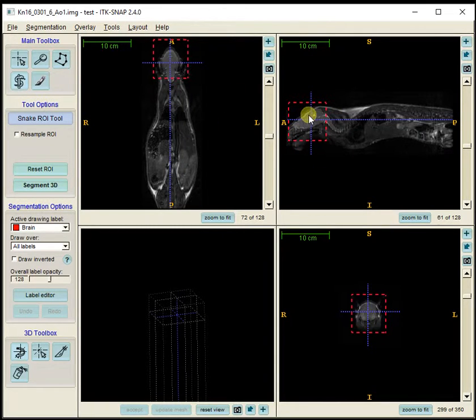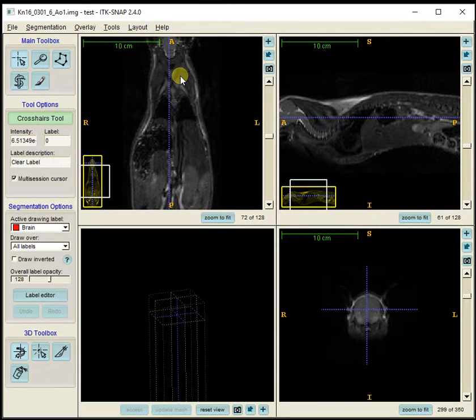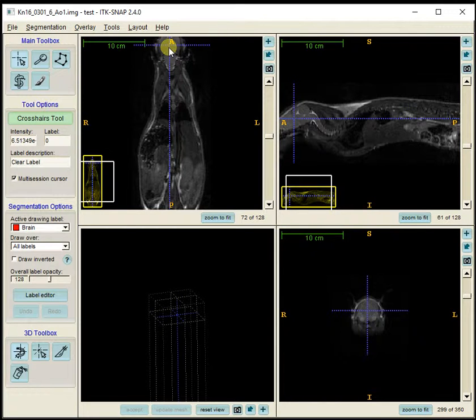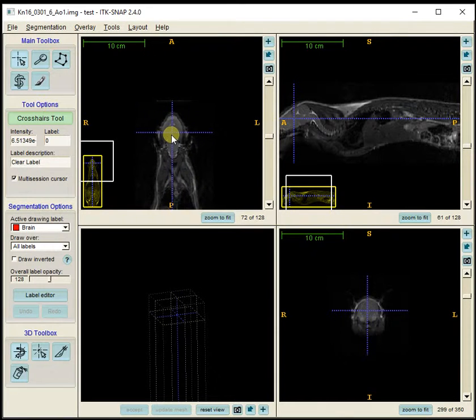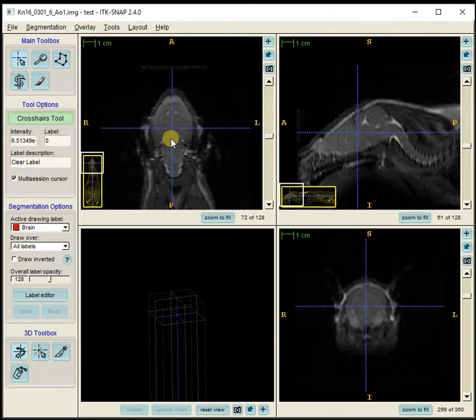It would be good to zoom in, so I go back to the crosshair tool and zoom by pressing and holding the right mouse button. To pan the image, I press and hold the Control key on the keyboard and then press and hold the left mouse button. I'll do that for each of these planes, then zoom in and pan again as necessary.